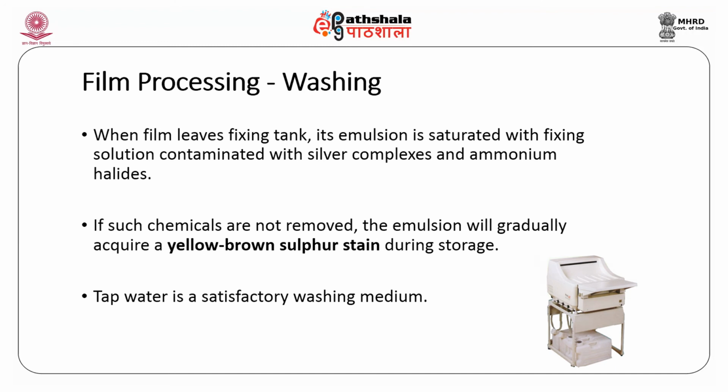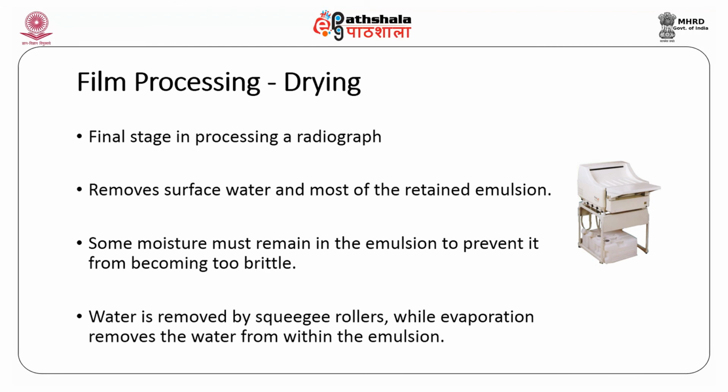And then we move on to the drying. Drying is the final stage of the processing cycle. After we dry, we have a good radiograph which can be seen by the clinician. During drying, it removes the surface water, most of the retained water in the emulsion. Some moisture must remain in the emulsion to prevent it from becoming too brittle, otherwise it will start breaking.